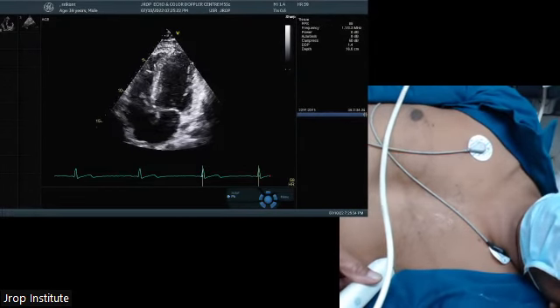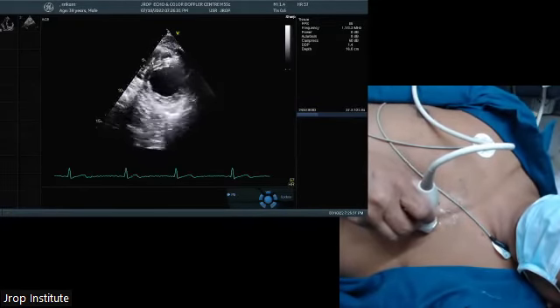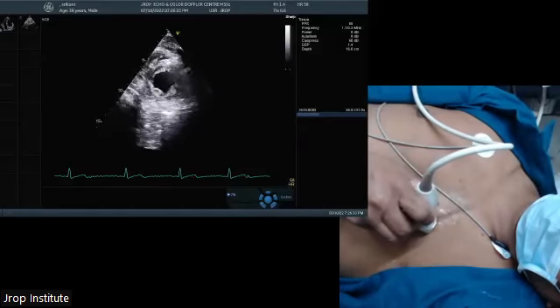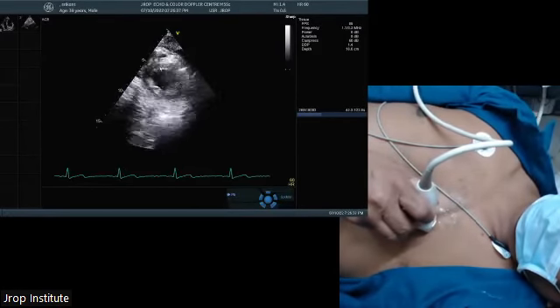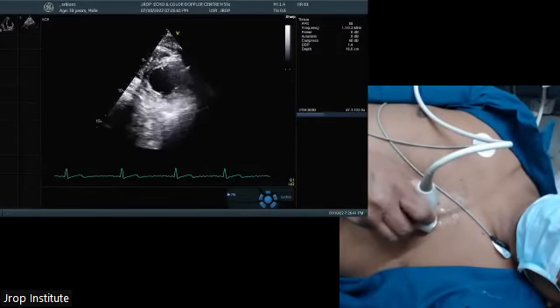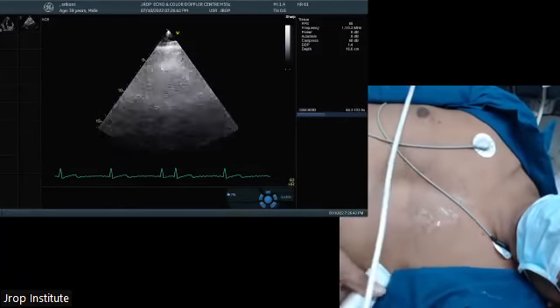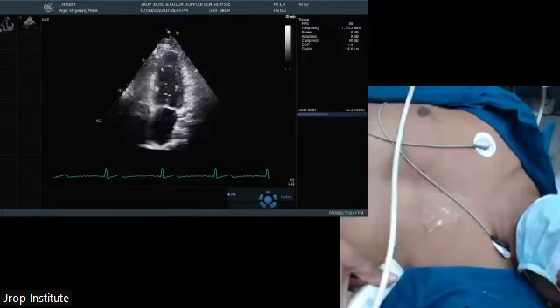Okay, sir. But here, the fibers which are working are not longitudinal fibers. They are transverse and radial fibers which are working. Ten years down the line, we were putting emphasis on looking at the cut section to talk about wall thickening abnormalities. No more in 2022. Because whenever the longitudinal function in this four-chamber view goes down, the radial and circumferential function takes over.